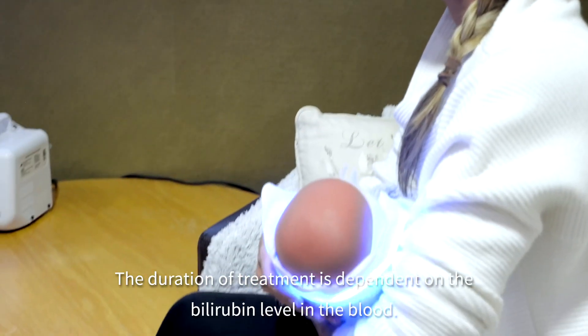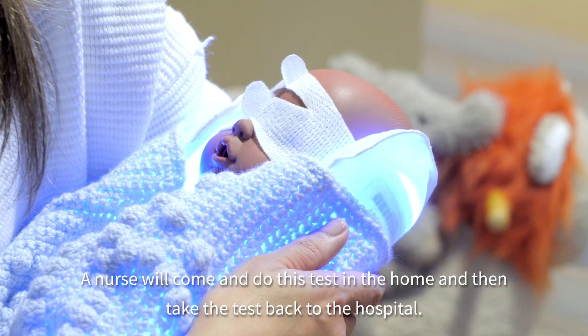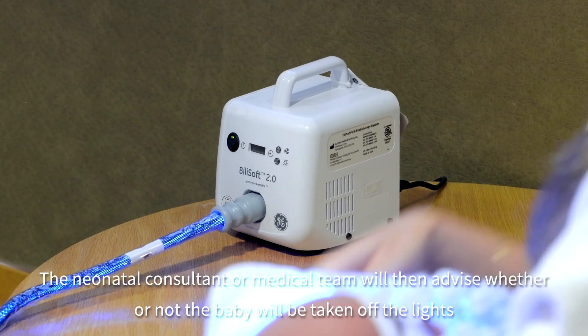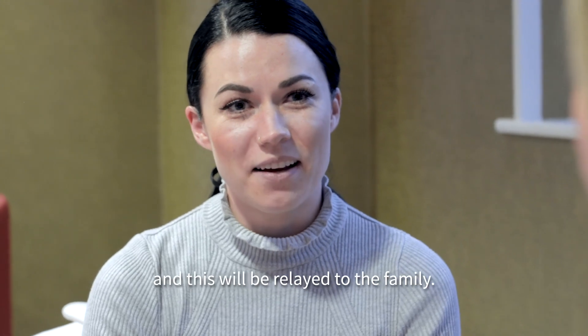The duration of treatment is dependent upon the bilirubin level in the blood. A nurse will come and do this test in the home and take the result back to the hospital. The neonatal consultant or medical team will then advise whether or not the baby will be taken off the lights, and this will be relayed to the family.